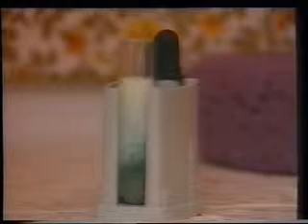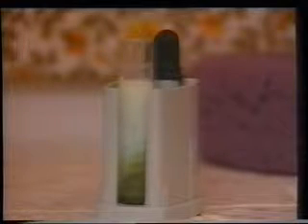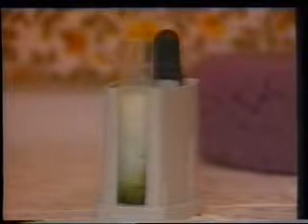The tablet then reacts with the liquid and bubbles up. The mixture is actually boiling, and the tube becomes quite hot, so always leave it in its holder at this stage. If the liquid goes orange, even for a second when it's boiling, it means there is more than 2% sugar in the urine.